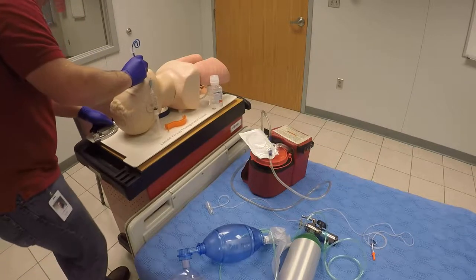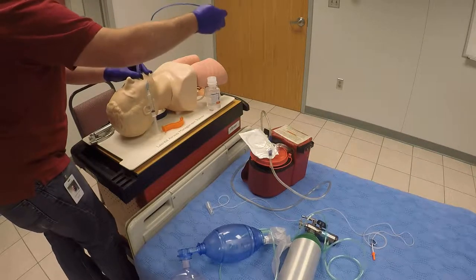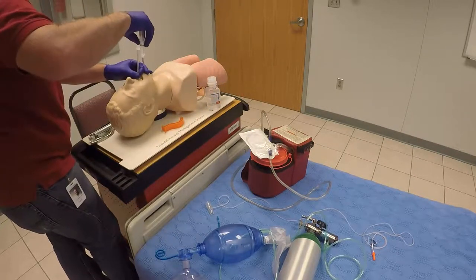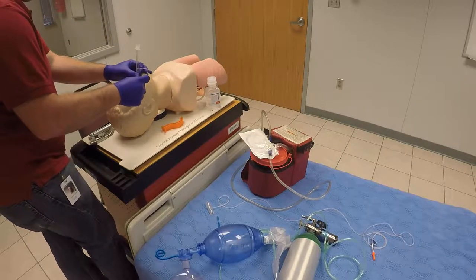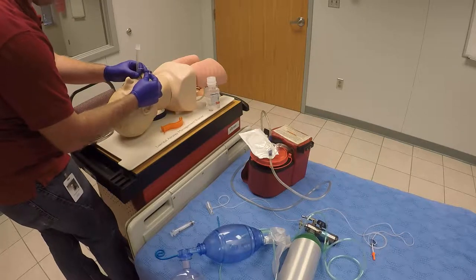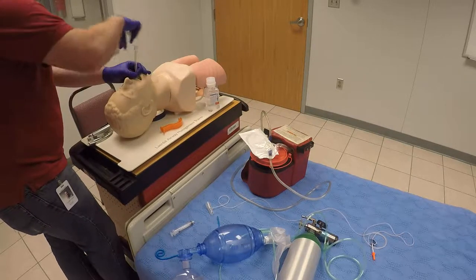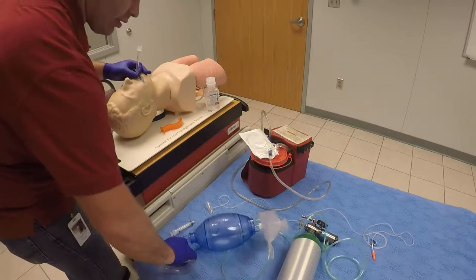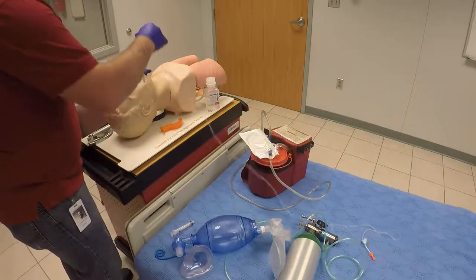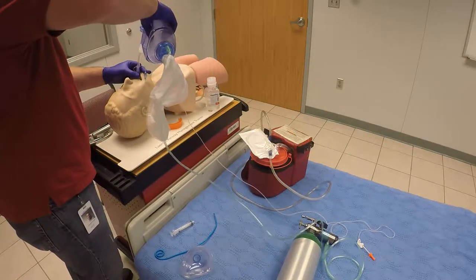Remove the laryngoscope and remove your stylet if you used it. Go ahead and inflate your cuff and remove the syringe. Make sure the bulb there is nice and tight. You can go ahead and put on your capnography at this time in between your BVM and your ET tube, and begin ventilating your patient.